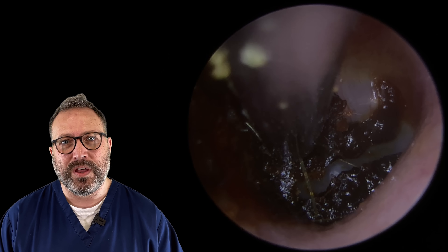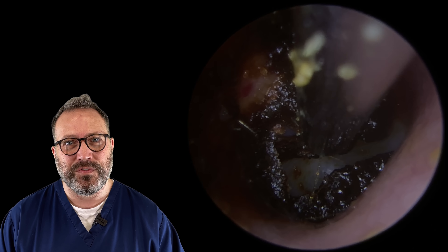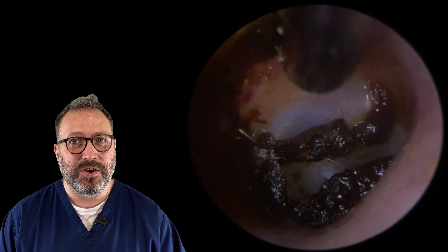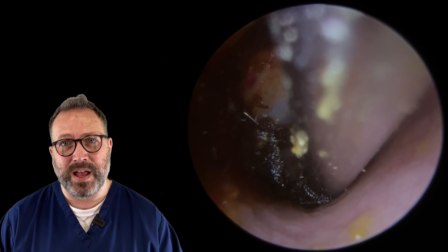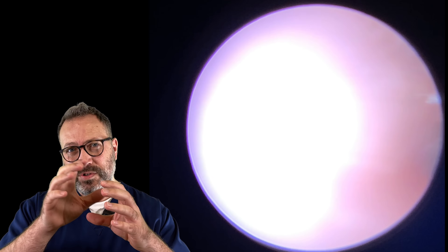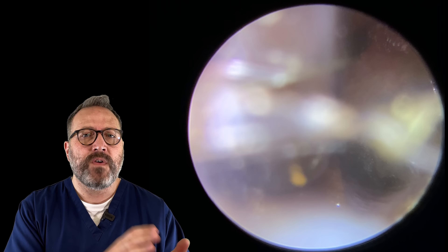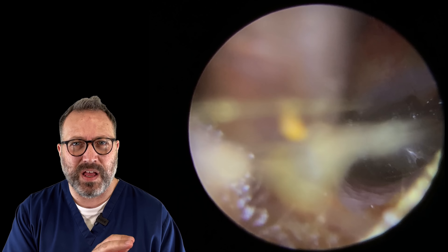You can see we're just slowly working our way around. You can actually see the wax getting sucked into the machine from the eardrum - it's coming away really, really nicely. Slowly teasing this off, we've exposed the top section and the middle section is starting to get exposed. We're aiming for the bottom now. Another section is coming away - we've exposed about two-thirds of the eardrum now. We've got the central line running through there and we've also got this peel left to do on the left-hand side. We're working very, very close to this patient's canal walls, which patients can sometimes feel is a little bit uncomfortable.